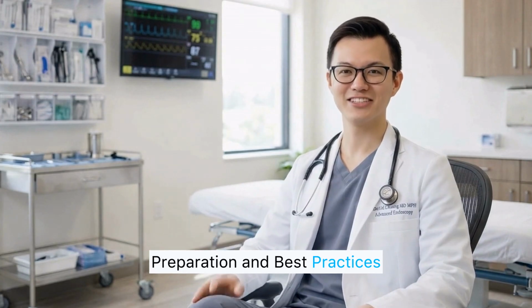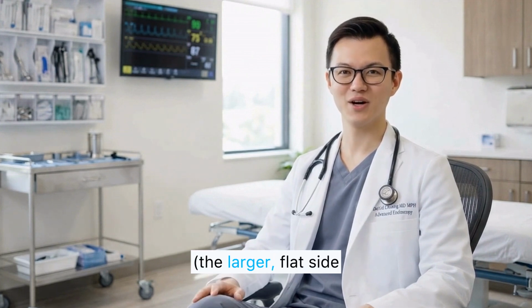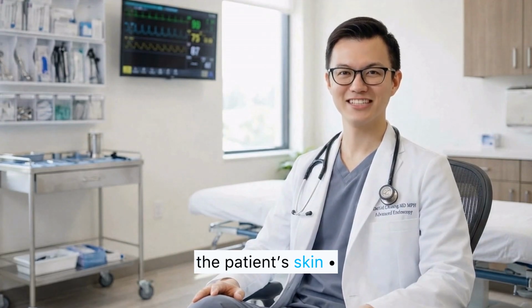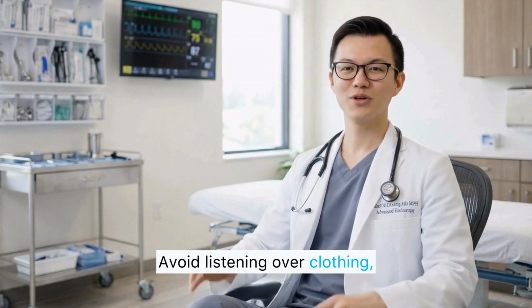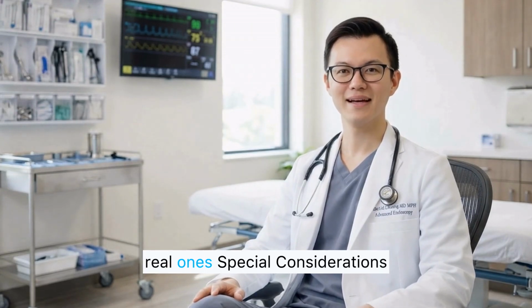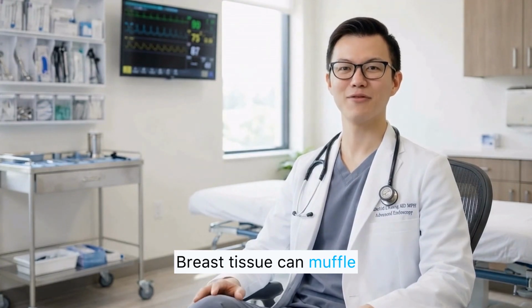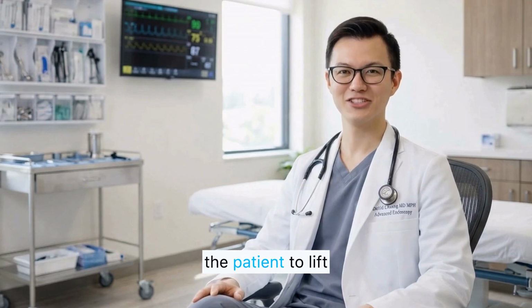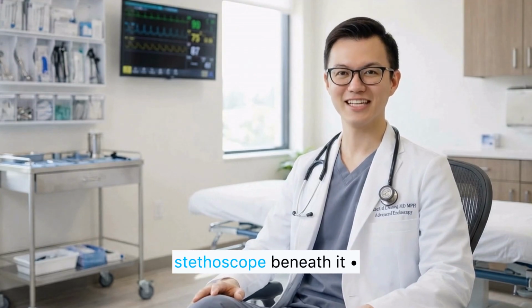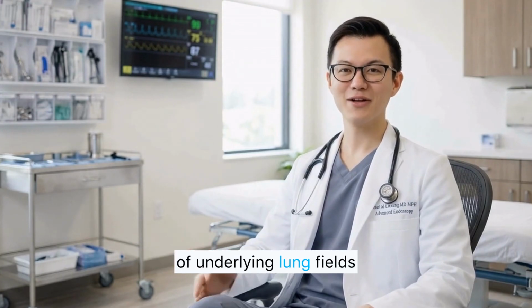Preparation and best practices for lung auscultation. Use the diaphragm correctly. Always use the diaphragm, the larger flat side of the stethoscope. Place it directly on the patient's skin. Avoid listening over clothing, as fabric can create false sounds or dampen real ones. Special considerations for female patients. Breast tissue can muffle lung sounds. Ask the patient to lift the breast tissue so you can place the stethoscope beneath it. This ensures accurate assessment of underlying lung fields.